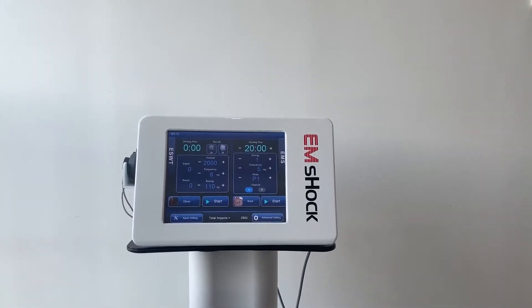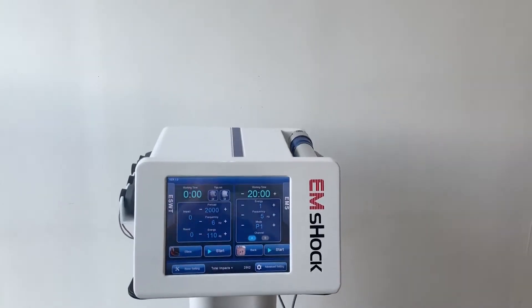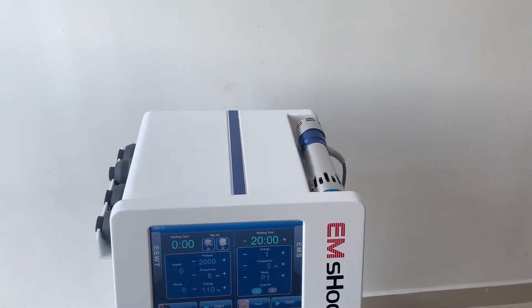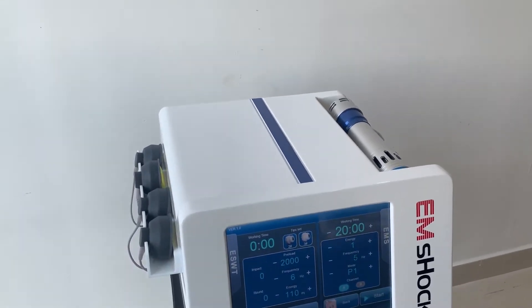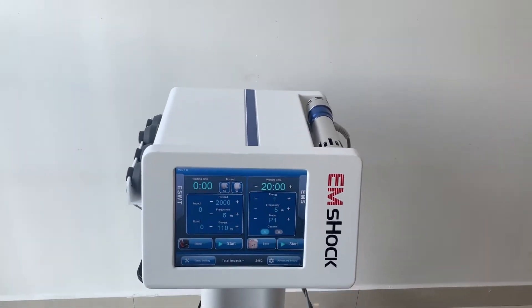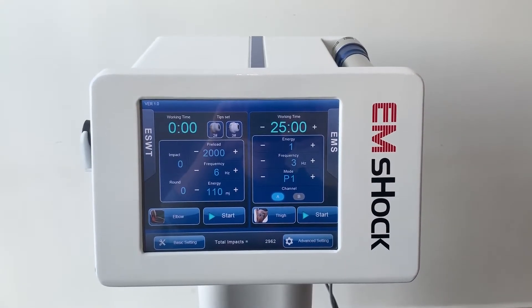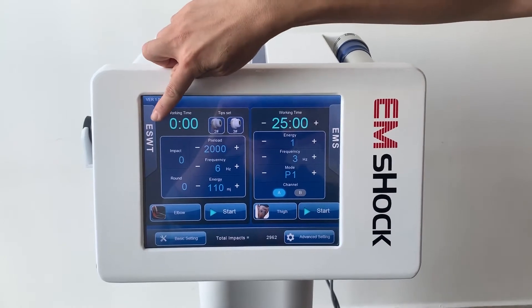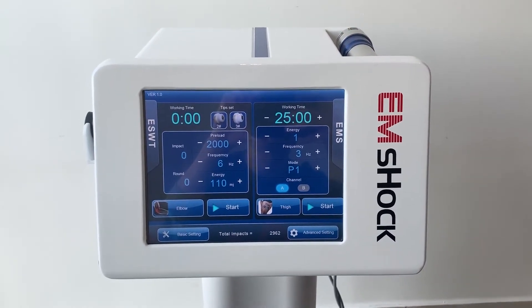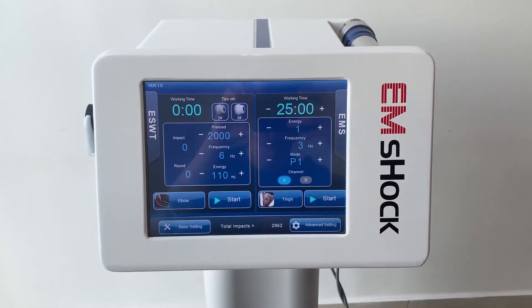The EM Shock upgraded from electromagnetic shock wave, with additional electric muscle stimulation technology, makes EM Shock a better physical therapy device. With new programming, it is possible to use the two technologies at the same time, with each technology targeting different body parts.